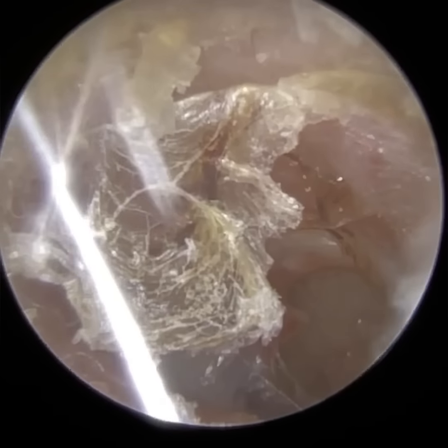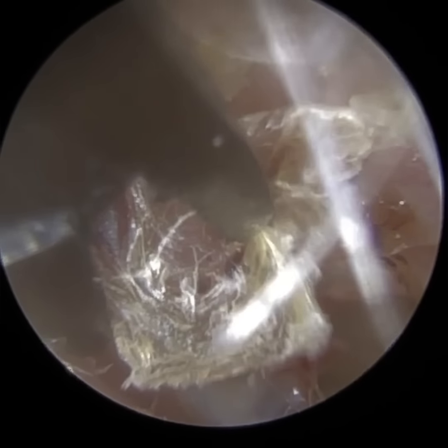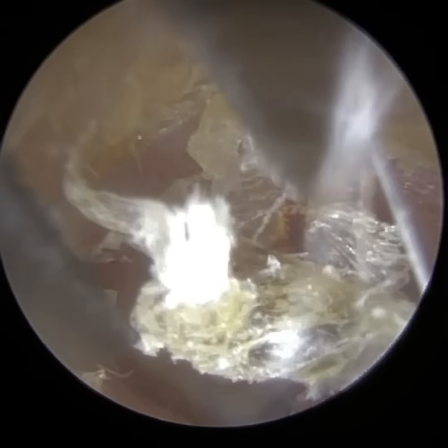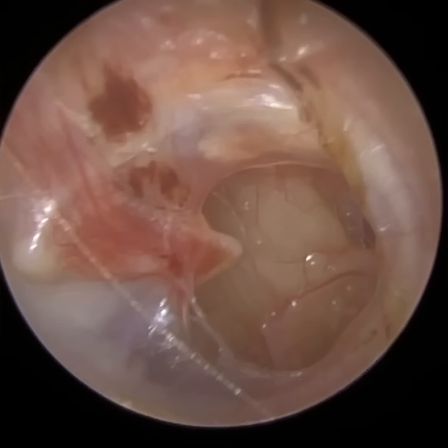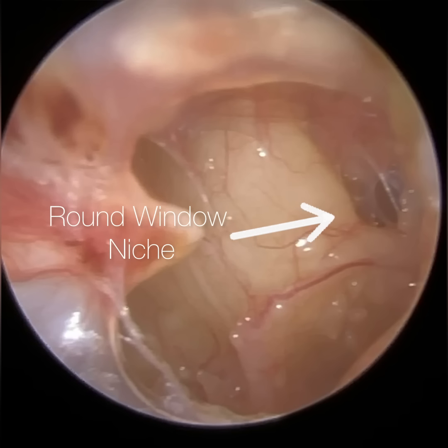And there were a couple of moments where the patient did find it slightly uncomfortable because although I've removed the main blockage, they could still feel a bit of discomfort and irritation in the ear. So I wanted to peel this away. There was a bit of, almost, I wouldn't say bleeding. There was a bit of, I'll come back to that in a moment. So that is the round window niche, and I will explain that in more detail, but it's quite an amazing view actually. It's not often we can visualize the middle ear.